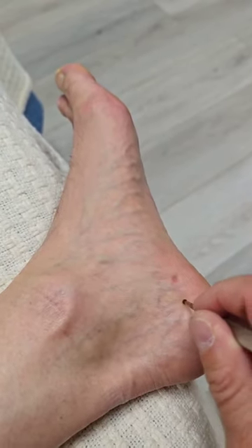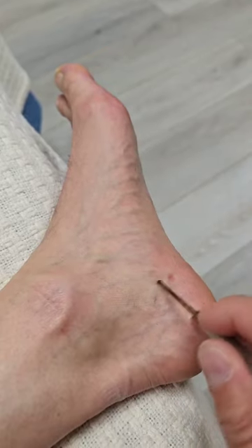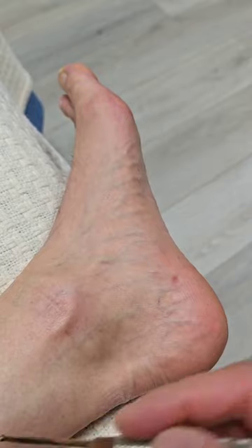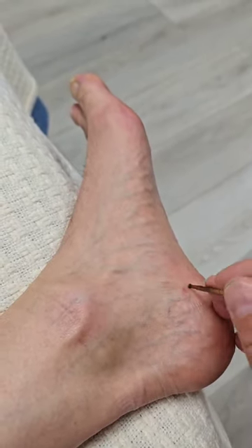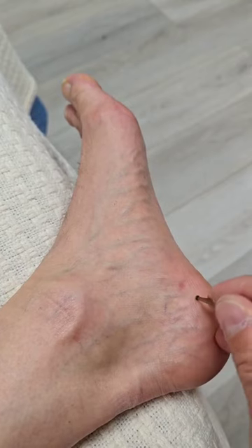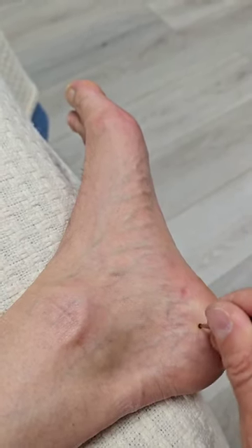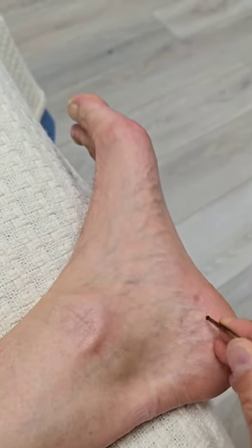Now, if you think it's pathological in the plantar fascia and it's not just myofascial, so this really would be for gastrocs and soleus if you're going up there for reason 3, abductor hallucis reason 3, quadratus plantae reason 3, you know, like the loading tissue referring pain in. If you think it's pathological as well, what you can do is, there tends to be some thickness and pathology back here. You can take your needles and you can site them around the calcaneus at about this level.